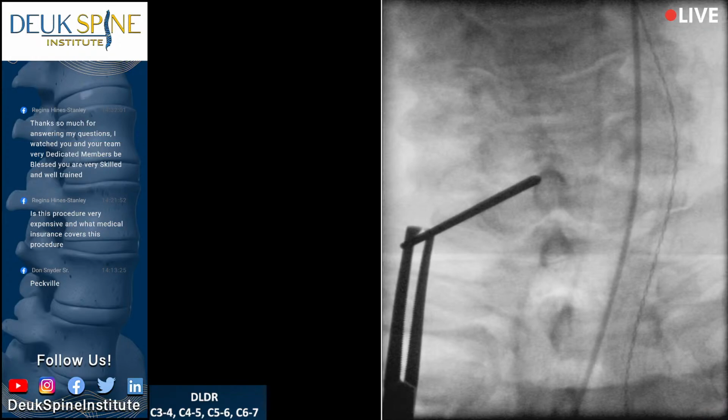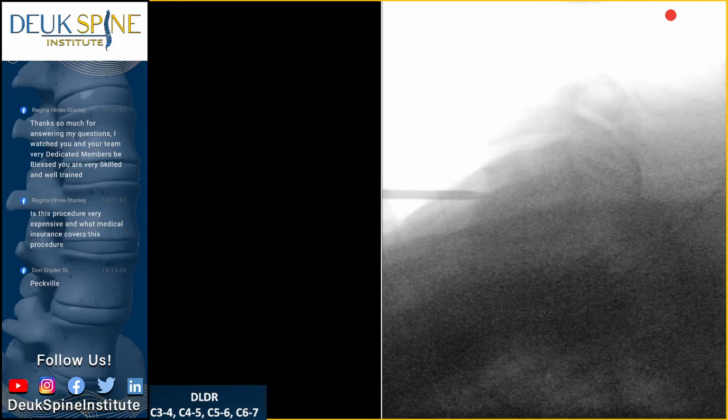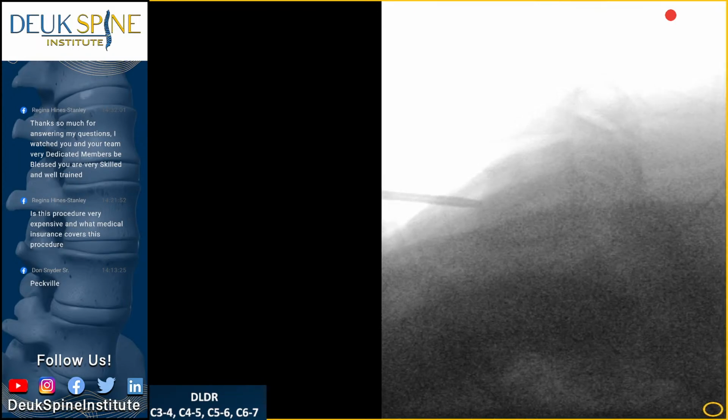All right, everyone stay where you are and go lateral. This will be our last push. Let's see what we can do. I just feel some resistance and I don't want to overdo it because 4 level with 1 incision. Feels like there's just a big bone spur here.